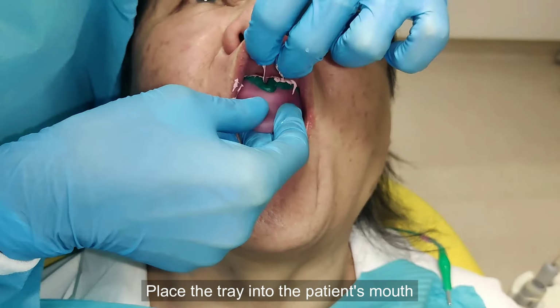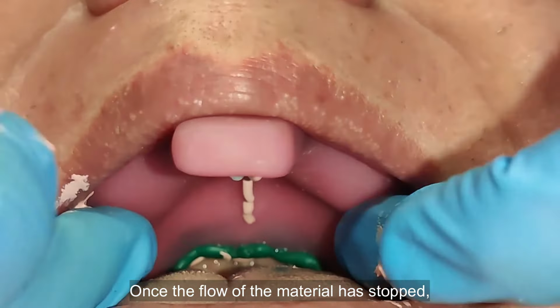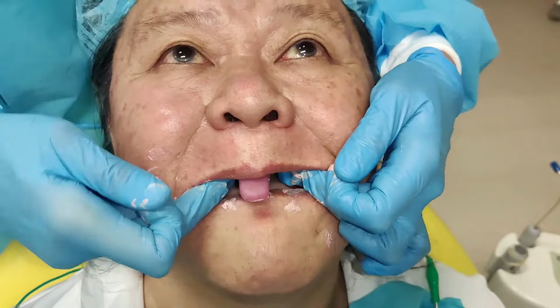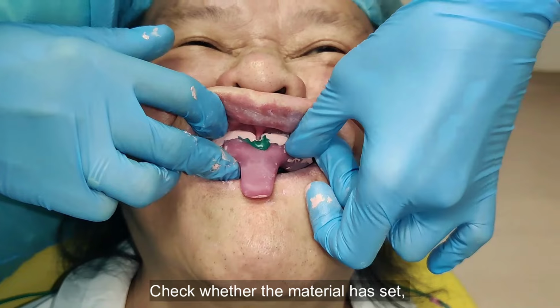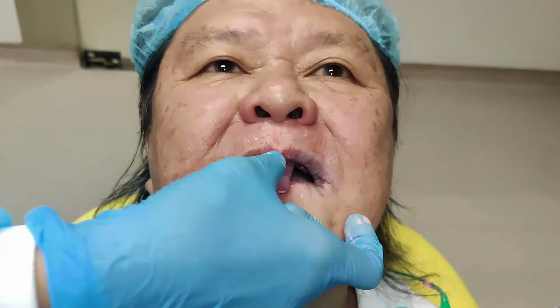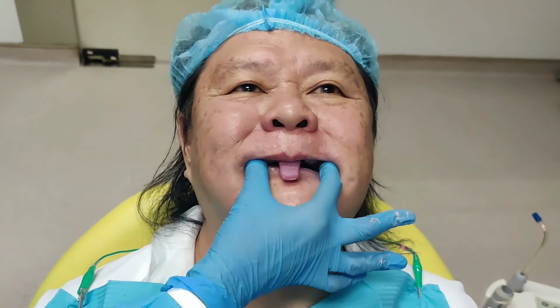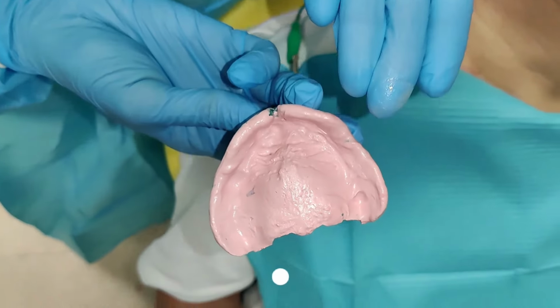Place the tray into the patient's mouth and ensure that the material flows out through the relief holes. Once the flow of the material has stopped, repeat all the functional movements which you have just performed. Check whether the material has set by trying to place an indentation with your fingernail. Check for retention, stability and support. You can see the zinc oxide eugenol wash impression here.